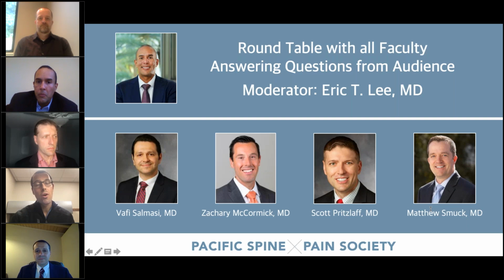I don't use it for patients with stimulators or pacemakers. I use bipolar lesioning with conventional electrodes to keep the energy simply between the two electrodes, where the energy is leaping across, as opposed to energy entering from the electrode itself and then leaving through the grounding pad, where you have the potential to possibly affect pacemakers or to potentially heat up a stimulator battery or that sort of thing.